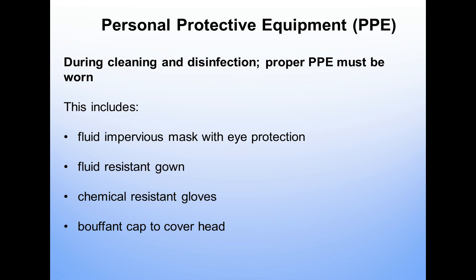So if you look at the central MDR departments, the medical device technicians there always wear their PPE. Sometimes if you have many jobs and many duties, you may not take the time to wear your PPE, but it is very important, and you have to protect yourself.